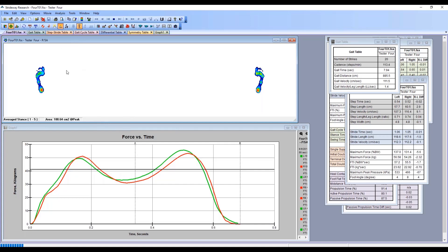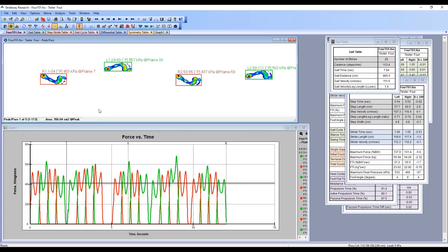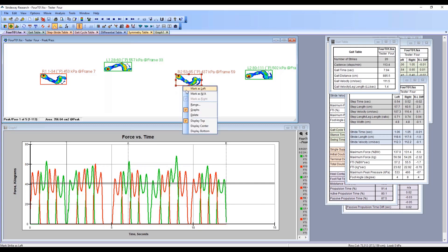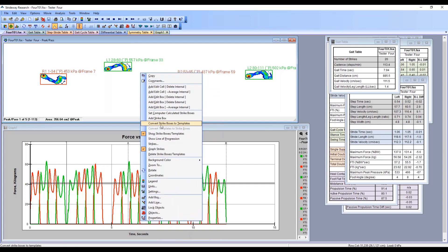One last thing I wanted to share is our templating feature. This is essentially showing you total force right now. If you're interested in really understanding what's happening at the different phases of gait and you want to break the foot down into different templates, we have one that you can use right off the bat.